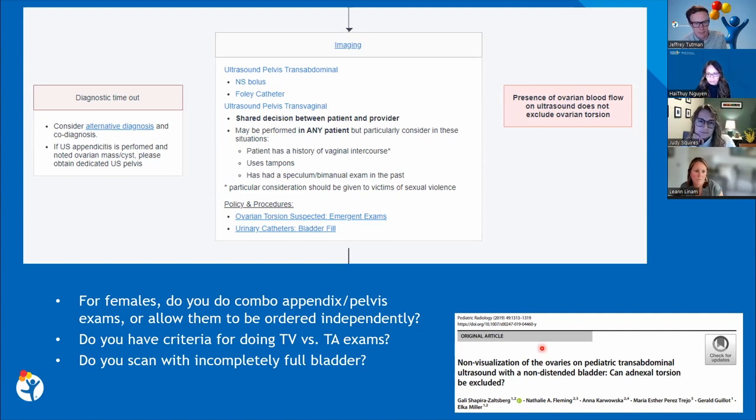time your arrival with when the patient's full. But if they're not full, then just go ahead and scan them. I don't want you to sit there for 2 hours waiting in the middle of the night. Have you guys taken a similar approach or run into that issue, or how have you approached that?